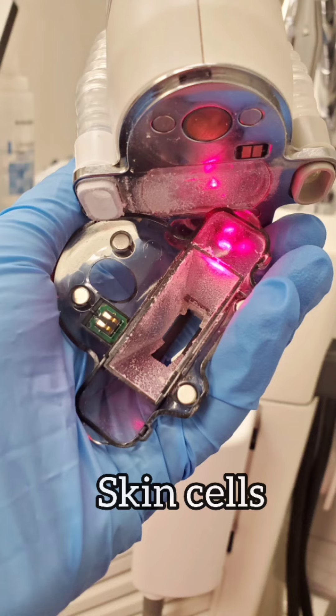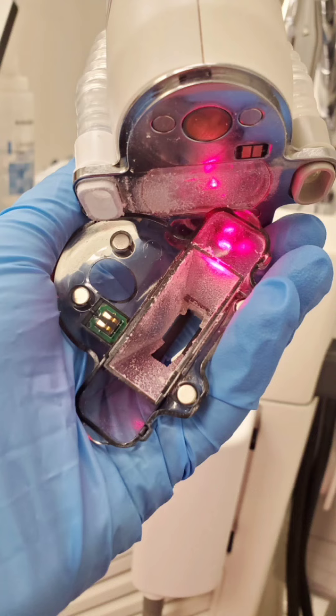Each time you're done with a section of the face or the body, you have to stop what you're doing, take the tip off of the Halo laser piece, and wipe away dead skin cells. Even doing that, you will still have dead skin coming off everywhere. Just an FYI — you do want to wear a mask when you perform this procedure.